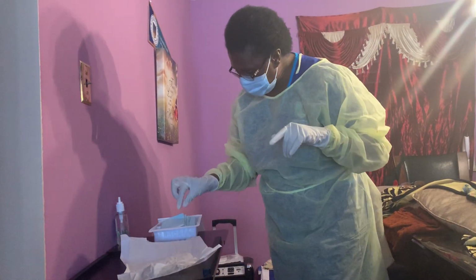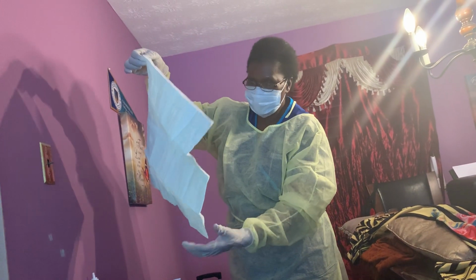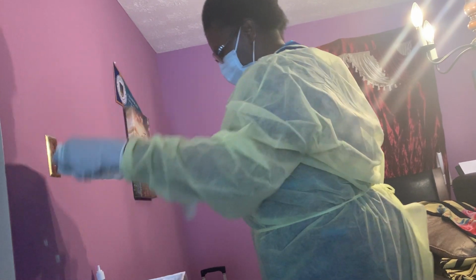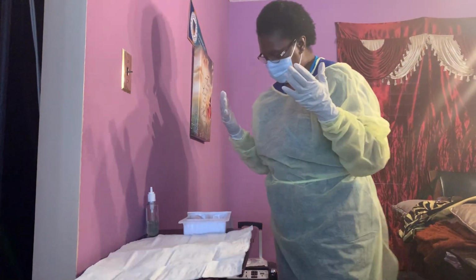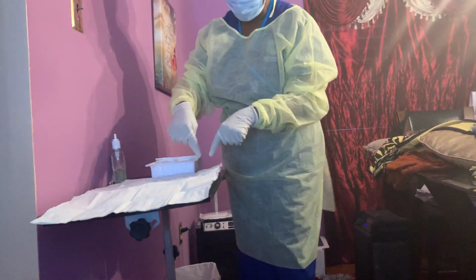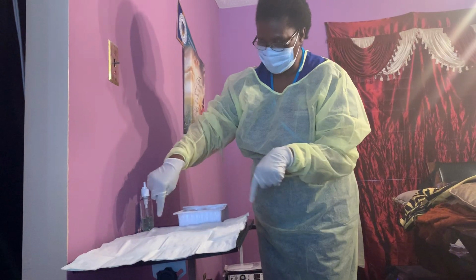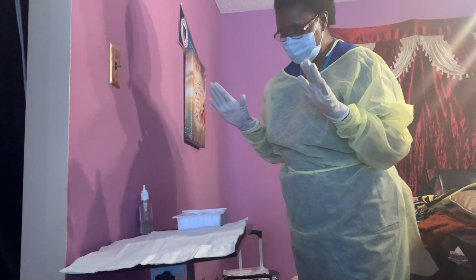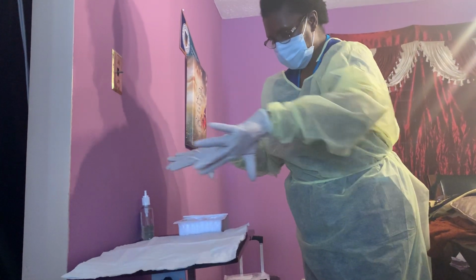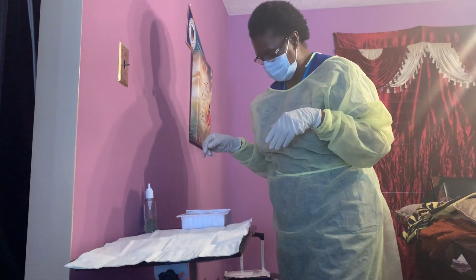So I have my sterile pad in here. I'm gonna pick it up from the edge. Make sure I open it, just touching the outside of the border. Assuming that paper is not there, but if it's there, it's the sterile paper that the glove came out from. I have a 1 inch or 1 centimeter, I believe, area of the field that is contaminated, so that is considered contaminated, that nothing sterile should be around that area. All the sterile material should be in the center of the sterile field.